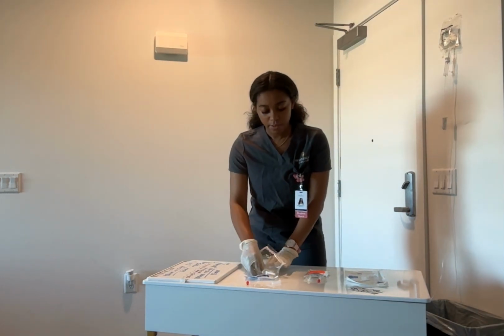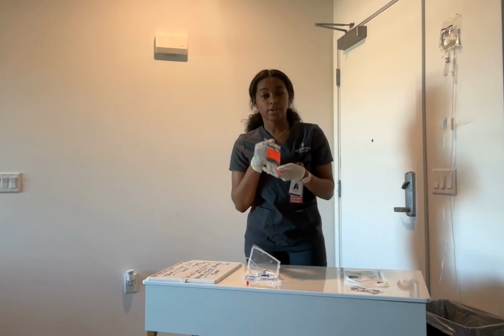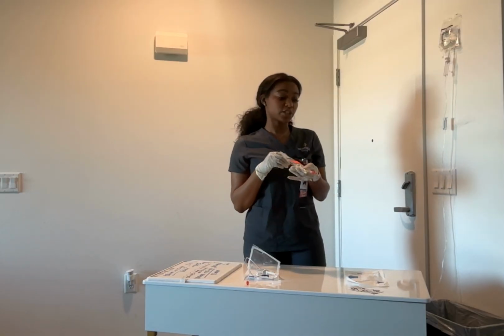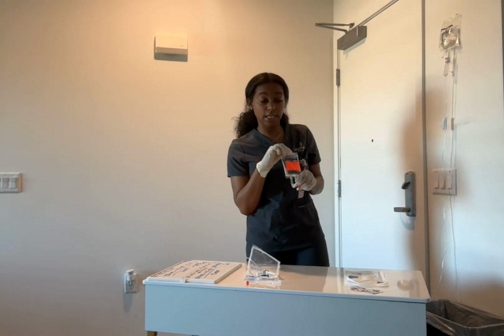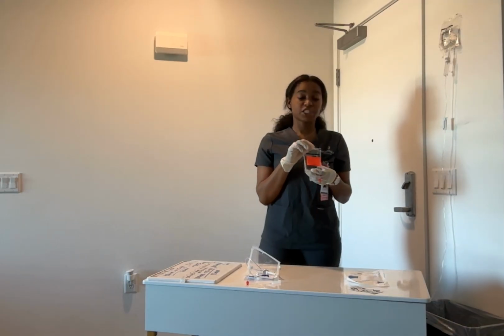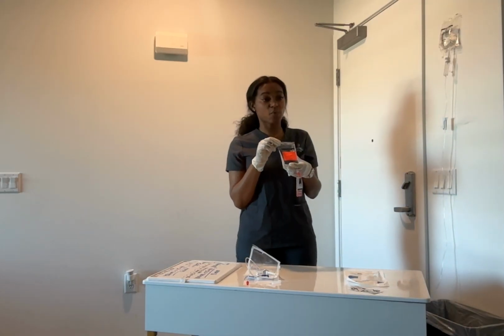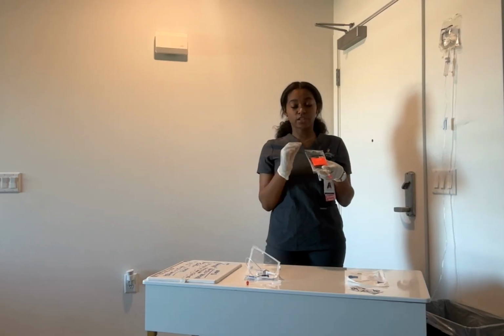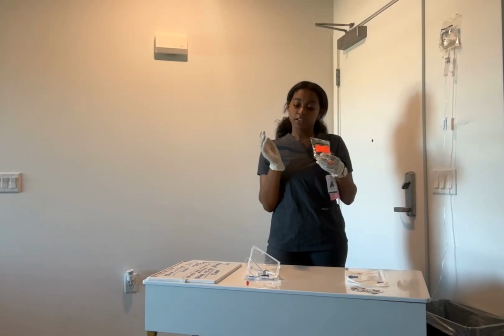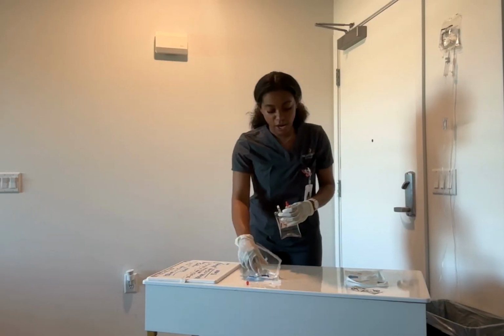I am then going to make sure that I have the amoxicillin. Again, I'm going to make sure the patient knows that this is amoxicillin. Make sure that they're not allergic to anything. Going to do the right patient, right dose, right time, right route, right drug, and right documentation. Patient denies that they're allergic to amoxicillin. So great. So we're going to prime this.